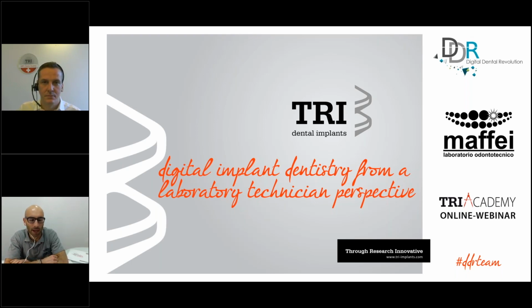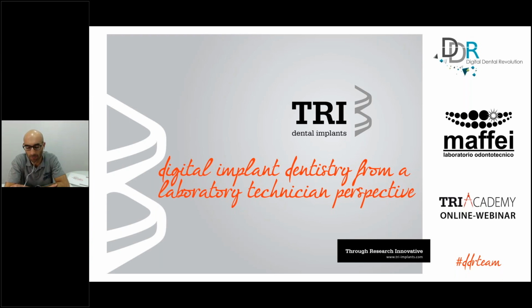Okay. Perfect. My topic of today is about digital implant dentistry from a laboratory technician perspective. So from our side, what we can do, what we have to do when the dentist sends us a digital impression, especially on implants. We will see some advantages of the product, and then we will see some workflow and different prosthetic restorations. So what are the benefits, what are the advantages of using this digital technology combined with a very, very good product.